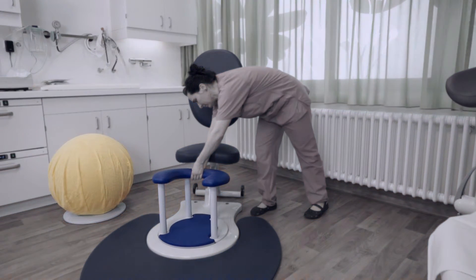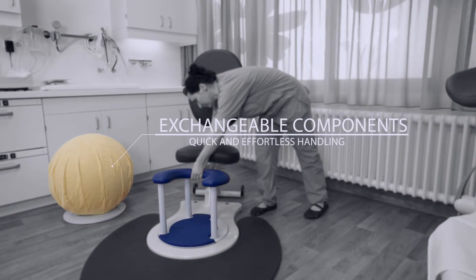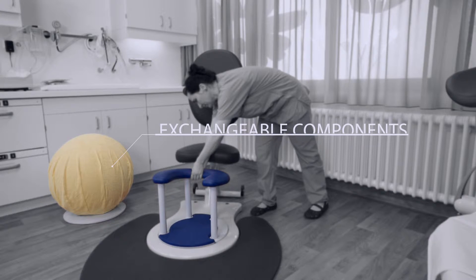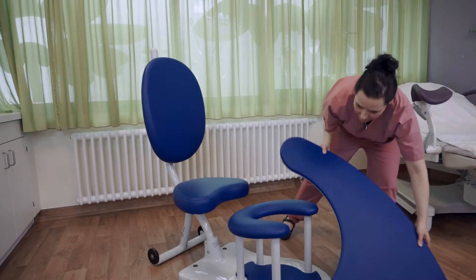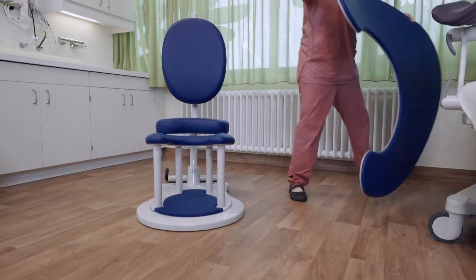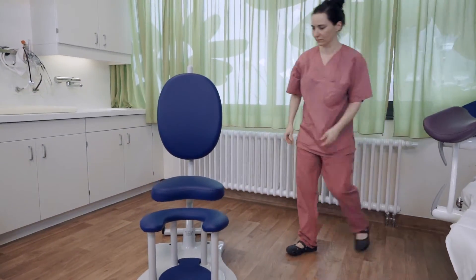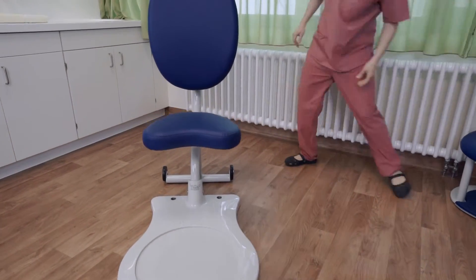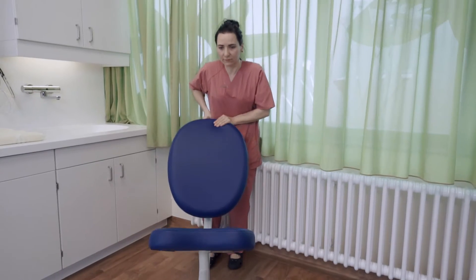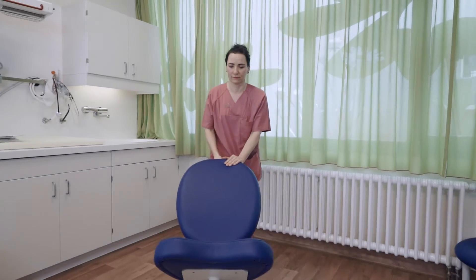Our delivery systems adapt to the specific needs of the mother in labour thanks to their quick and completely effortless handling. Once the footmat and the Daltstein delivery stool have been removed, two casters fitted on the frame allow you to shift the system with perfect ease. This feature makes the system a versatile tool in the delivery room and allows for easy cleaning.